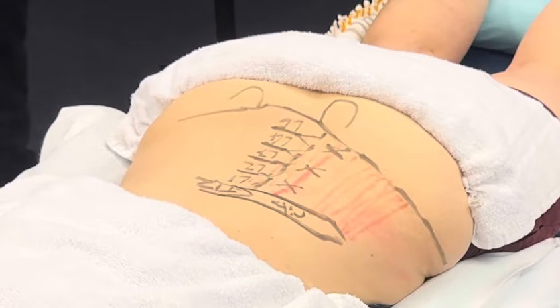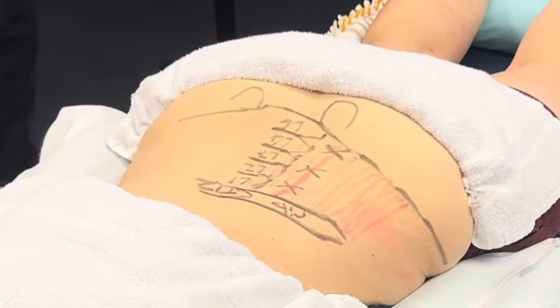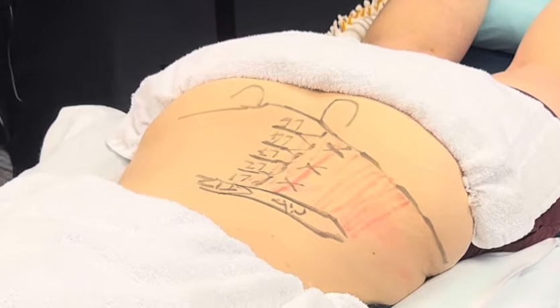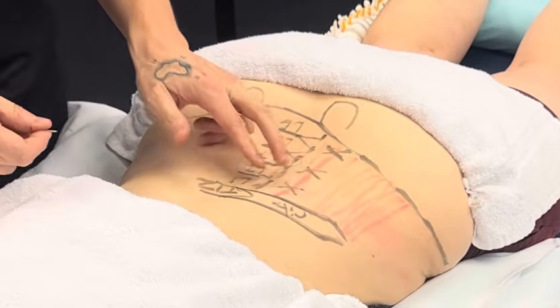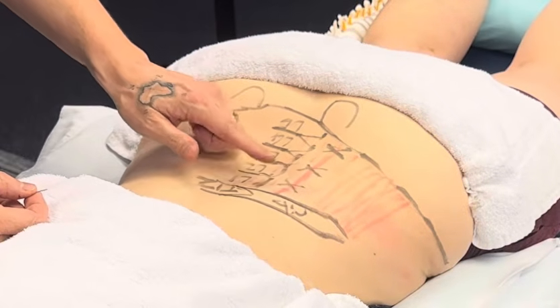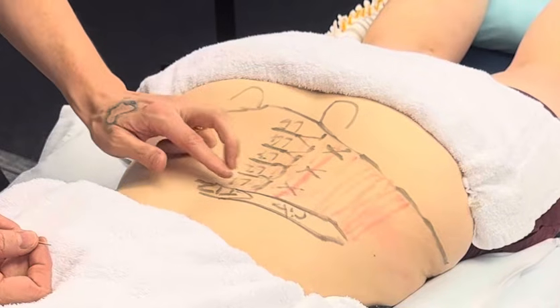I don't think we're gonna need all of that, but we might be surprised. This is the one place in the body, maybe in the thigh, where we might need the longer ones. What about the glute? Glute, yeah. Okay. That's a big one.